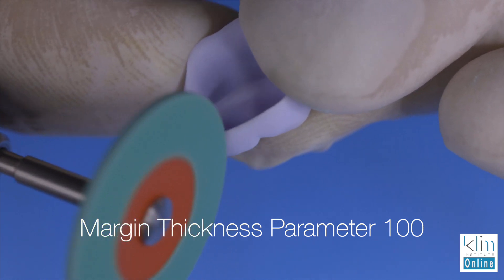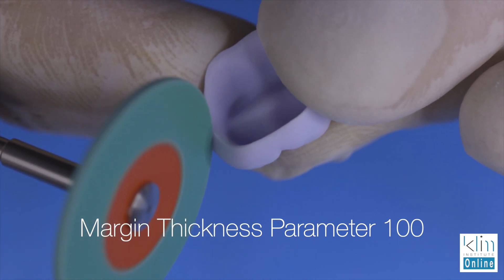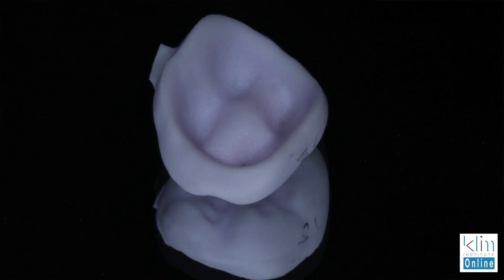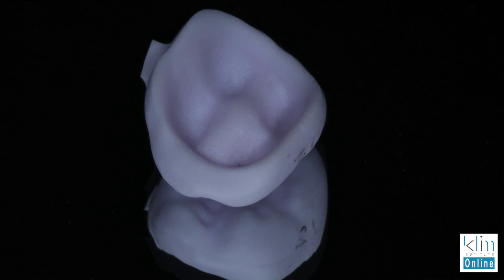I hope this tip helps you, particularly for those that really want those clean margins with Emax. Each material mills differently. Like if I'm milling a composite polymer type of restoration, you can mill those thin — there's no chipping, it's just a different type of material. Emax mills extremely well, but you do have to pay attention to some of these little rules.